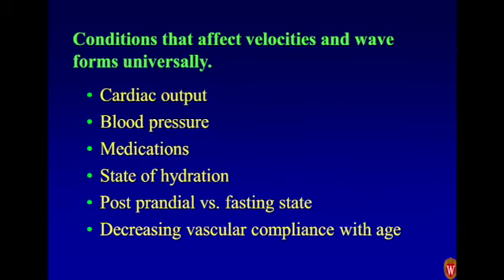But there are other conditions that affect velocities that really aren't a manifestation of the disease process you may be trying to diagnose. Cardiac output: how well is this person's heart pumping? If it's a weak heart, then the waveform is going to be altered, and that's really got nothing to do with the organ that you're looking at. It's just a function of the waveform that's arriving at that organ being disordered. Blood pressure changes can affect waveforms. Medications: is the patient on any pressors? State of hydration: is the person dehydrated or overhydrated?